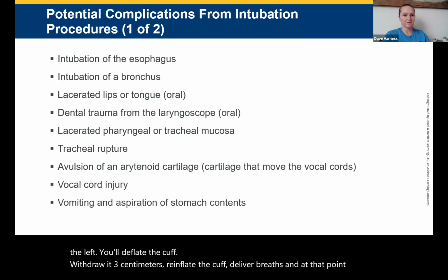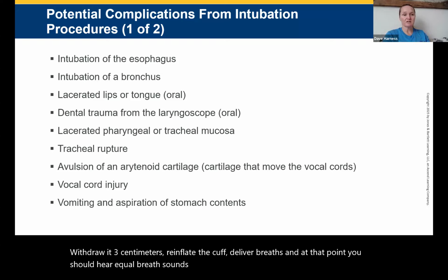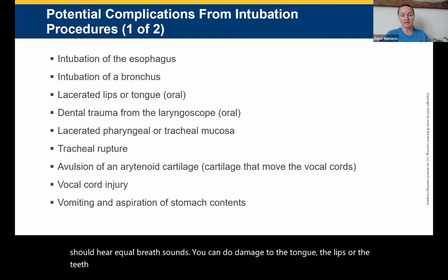You can do damage to the tongue, the lips, or the teeth. We're very careful. You'll get commented on to get off the teeth if you're putting the laryngoscope on the teeth.